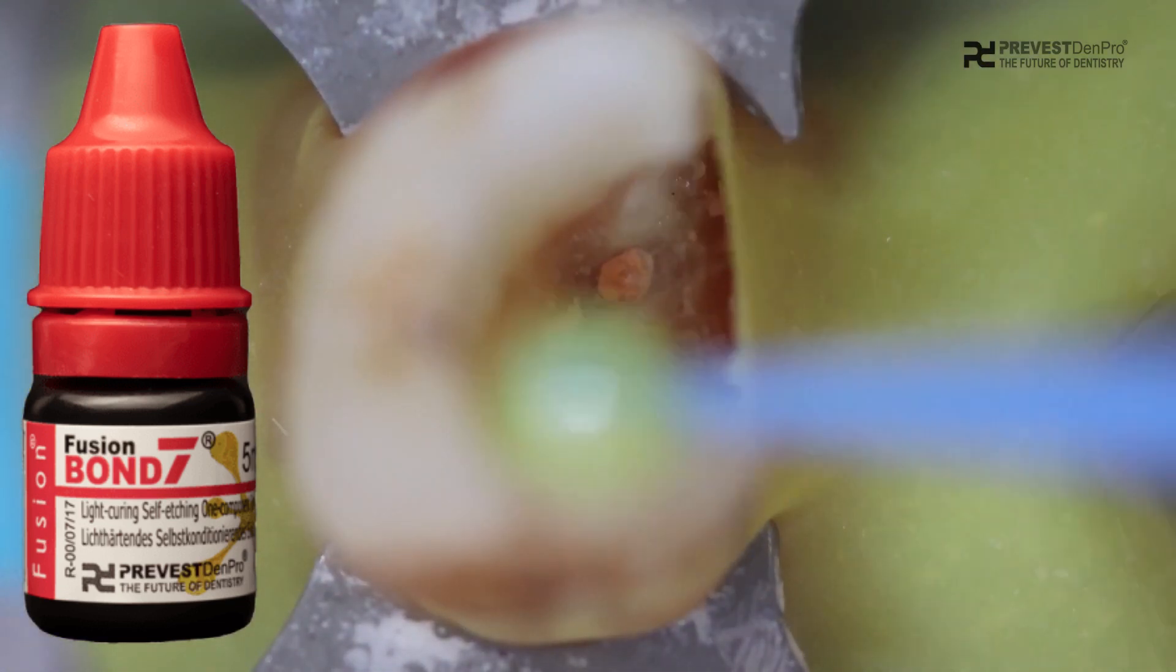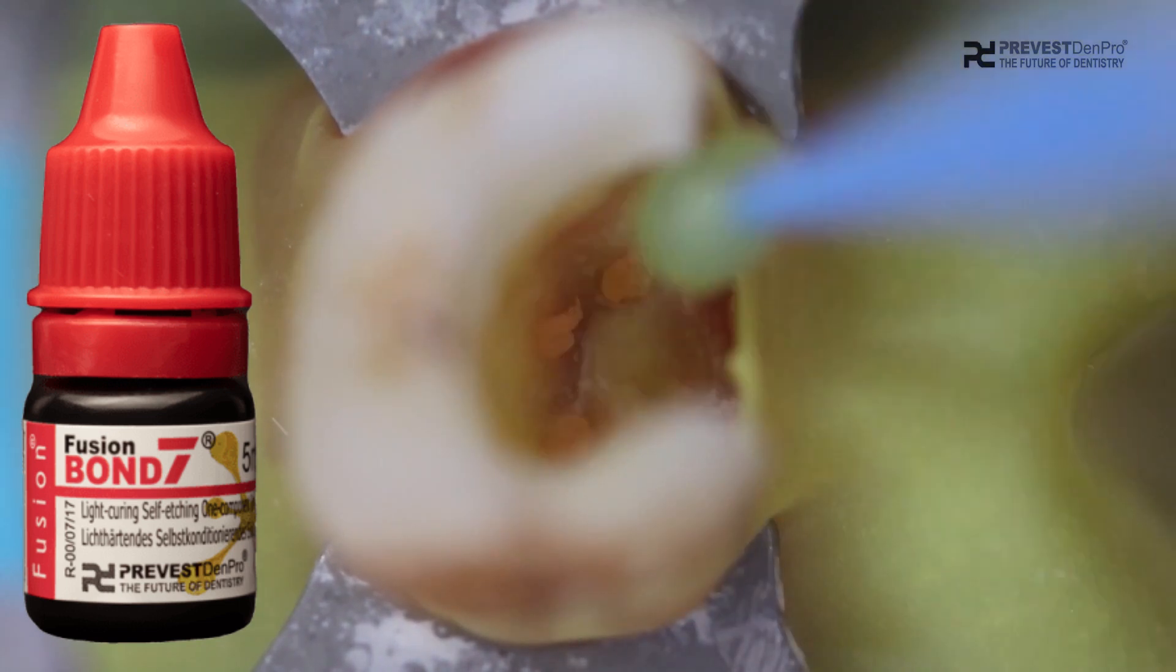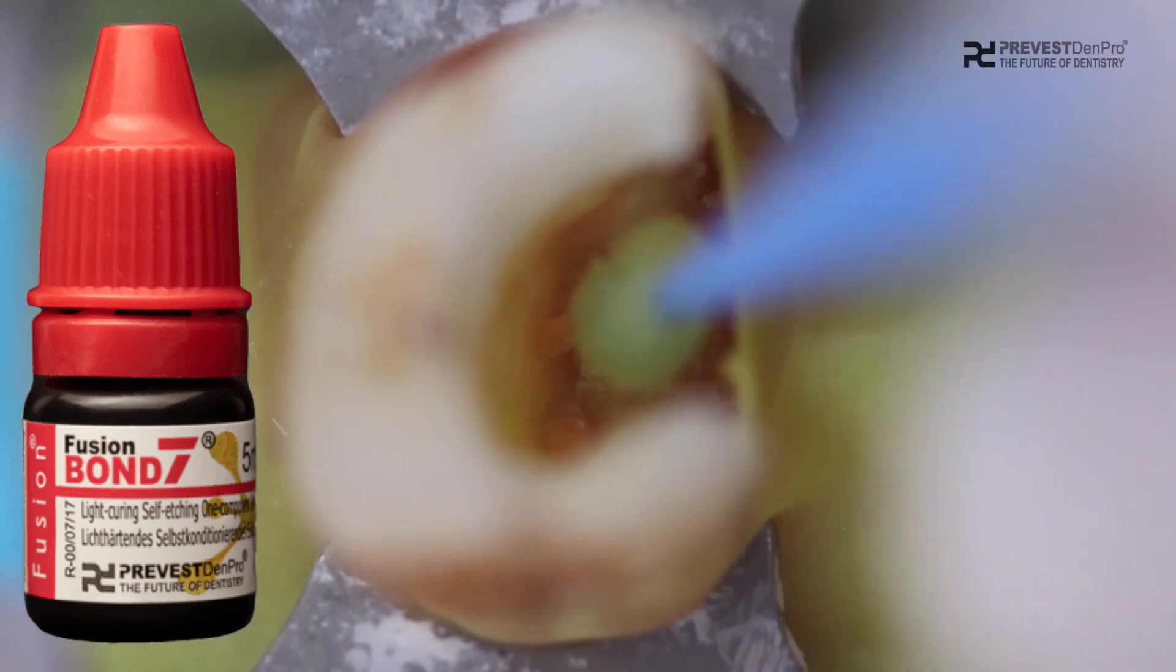This can be applied with the help of a micro brush in a brushing motion, vigorously into a clean cavity, and then it can be light-cured for 20 seconds.